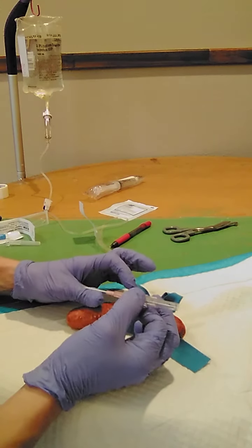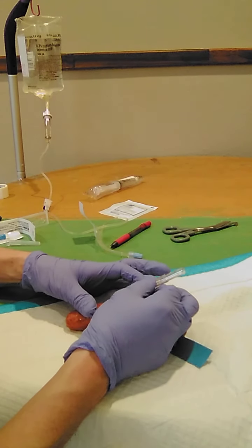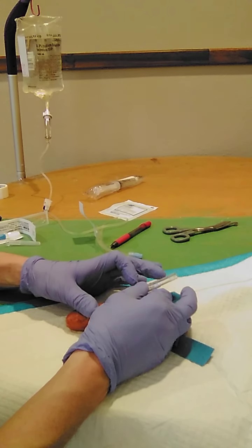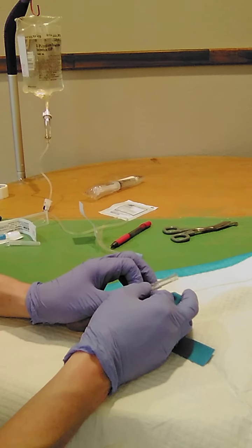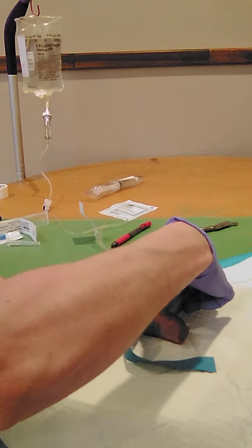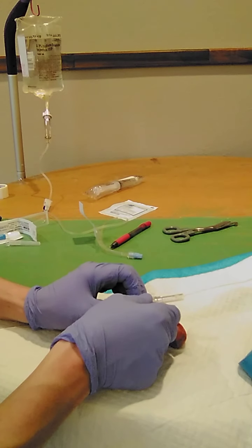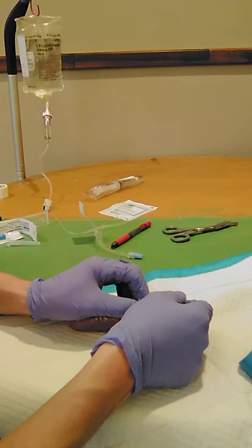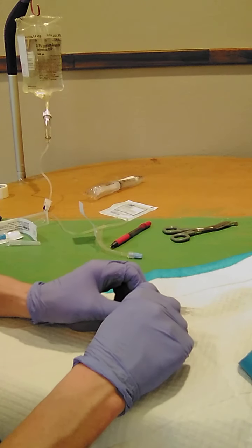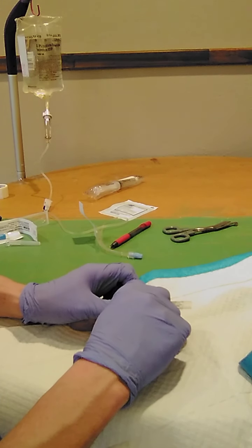Now with my non-dominant hand, I'm going to pull the skin taut distally on that extremity, and I'm going to pierce this at a 10 to 30 degree angle, watching for when I achieve flashback. Okay, I have achieved flashback now. Now I'm going to release the tourniquet, apply that down against the skin, retract the needle, and advance the catheter in so that the hub is quite close to the skin.